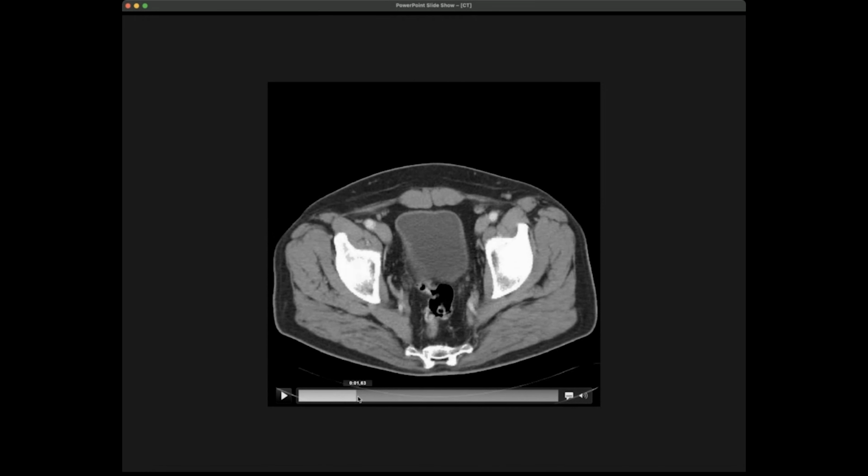And here you start to see again what we told you before, the very typical types of tissue that you can discriminate. On the one hand we have bone. Bone is very bright because the attenuation of bone is very, very high. Calcium attenuates a huge amount of X-rays, so what is very bright in X-ray images is mostly related to bone. What you then see is that muscle is something in between. Muscle is soft tissue, which is relatively close to water in attenuation coefficient.